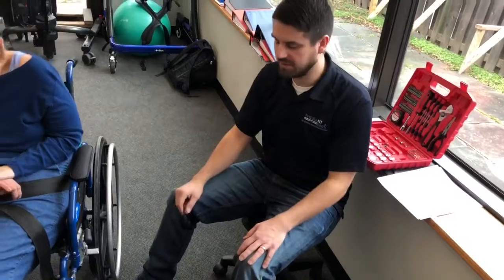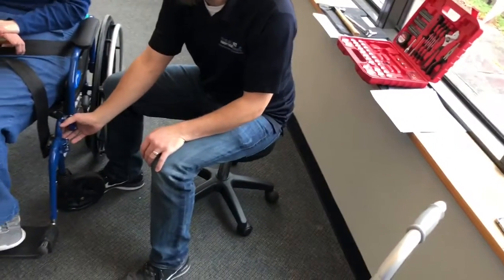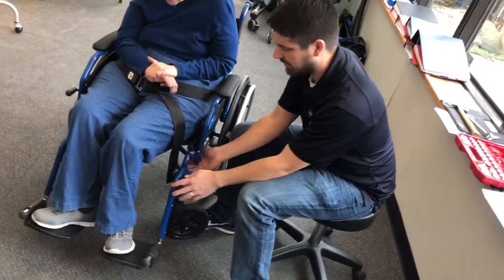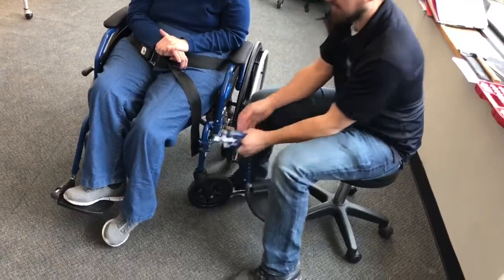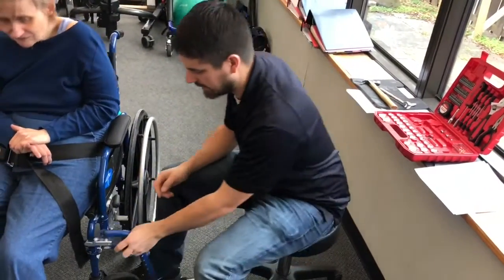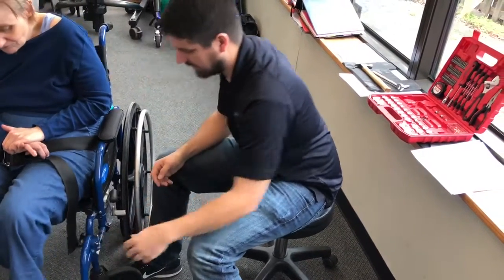so that we can understand how it operates. So if we're coming down here and we're looking at the footrest, most footrests are going to move and they're going to come off. There's this little locking mechanism right here that you just pull back and it releases them and they swing away. To get them on, you just pop the rivets in and then come back in like that.